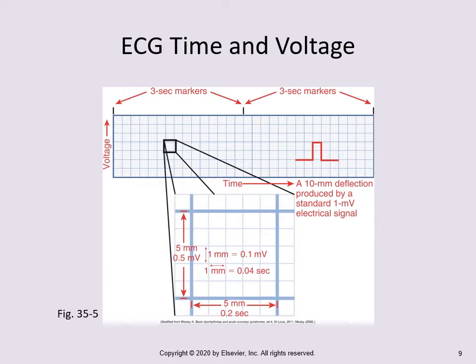B shows a typical EKG tracing in V1. I know you covered this in depth in adults, so just to review, this is a 6-second strip with each notch at the top representing 3 seconds. The boxes on the graph paper also represent increments of time. The large box is 0.20 of a second, with the small boxes inside representing 0.04 of a second.